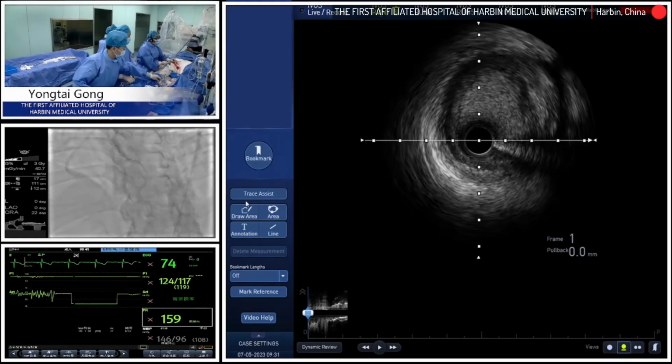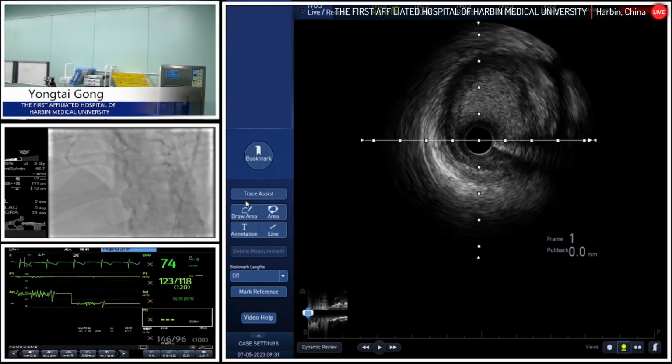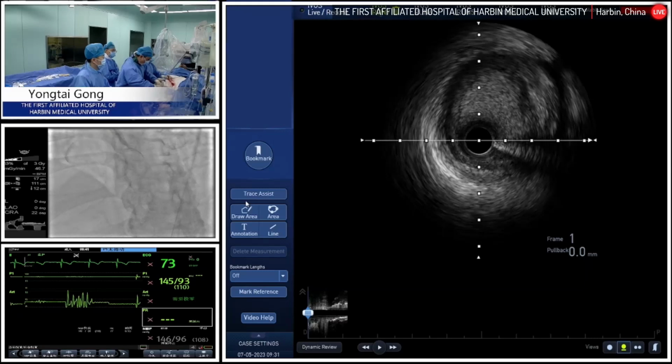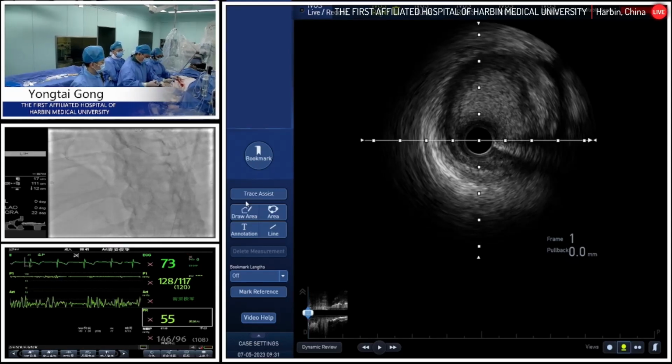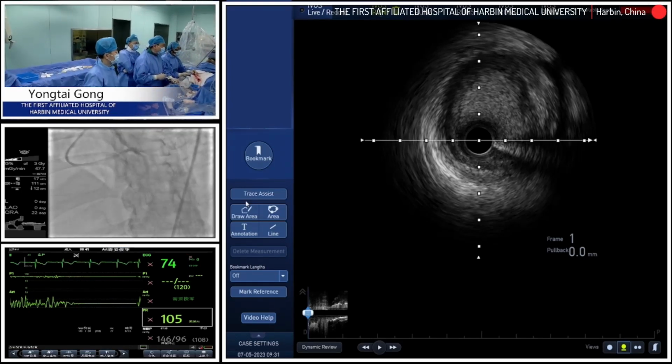And from the angiography, I noticed that maybe it's a provisional stenting. I think this strategy was used 10 years ago. Can you give me a little context? We noticed that there is no stent at the ostium of the diagonal. However, the stent seems to be crossed over to cover the ostium of the diagonal branch. So if they didn't perform the kissing strategies, I think there is some difficulty in passing through the FFR microcatheter. And later we may check.